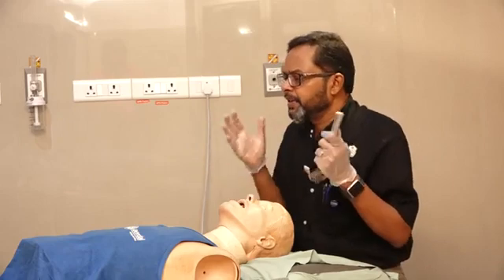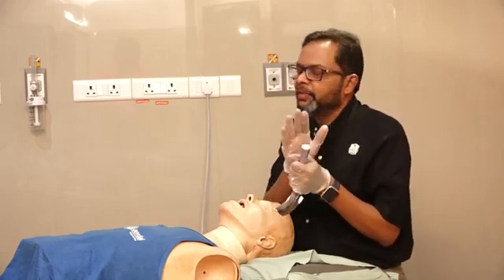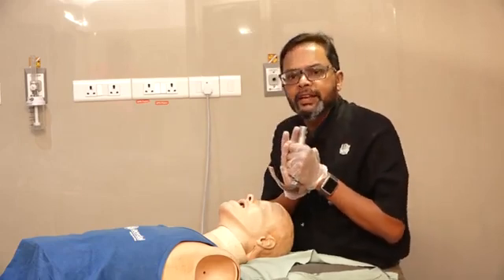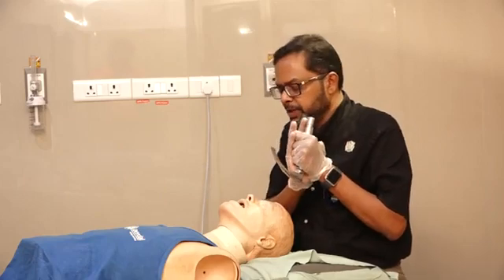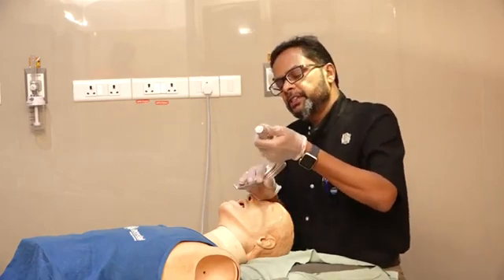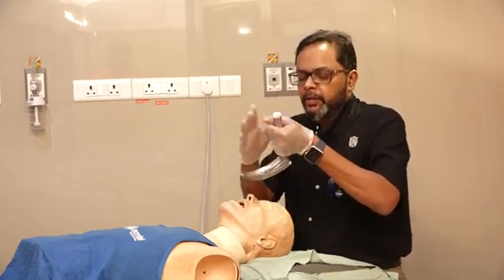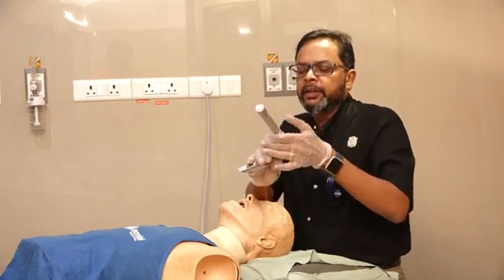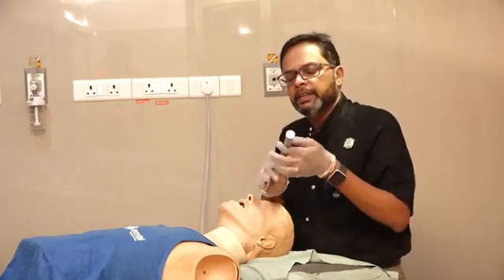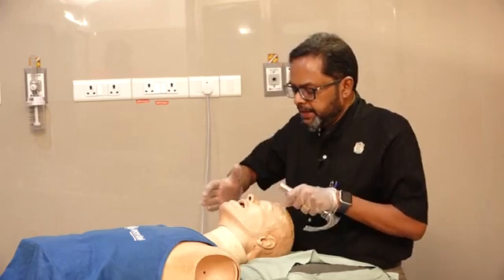Even for a left-handed person, only left-hand laryngoscopes are available, so always try to hold the handle only. Most people will hold it incorrectly — that is the wrong technique. You should always hold it correctly on the handle.